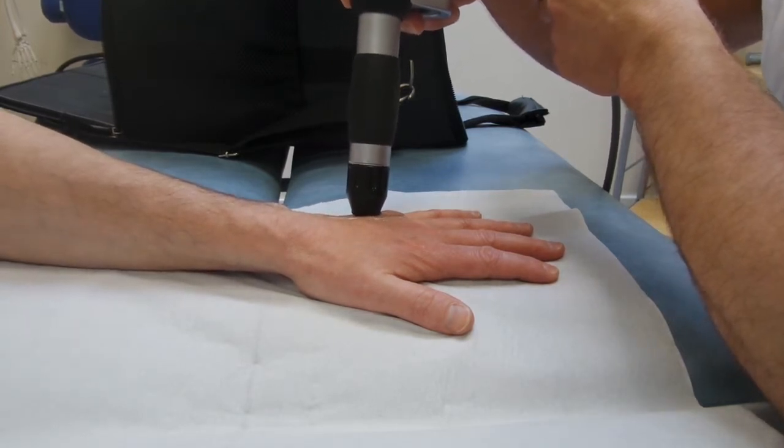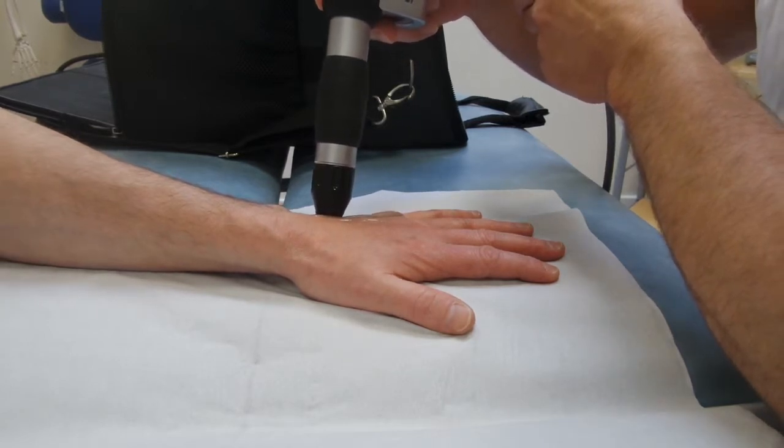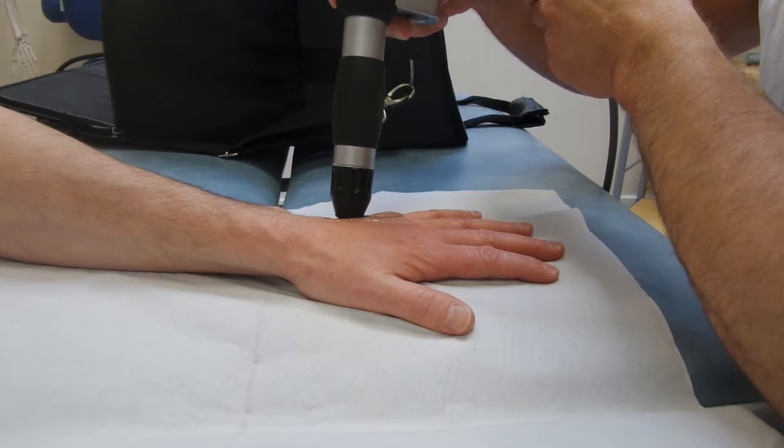You can see the patient is in a degree of discomfort. You can always tell when you're in the right area by the look of the patient's face. As I like to say, the fear in their eyes.